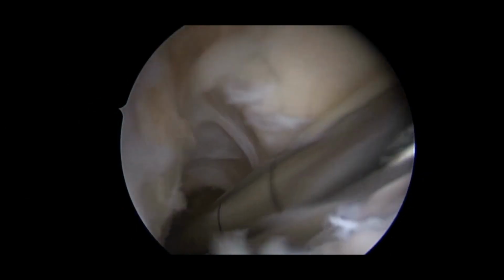I am shaving off the remnants of the anterior cruciate ligament in order to make space for the graft. This is the posterior cruciate ligament, which is intact. Just shaving off the remnants of the anterior cruciate ligament. I am cauterizing all these bleeders with this electrocautery in order to prevent any bleeding.